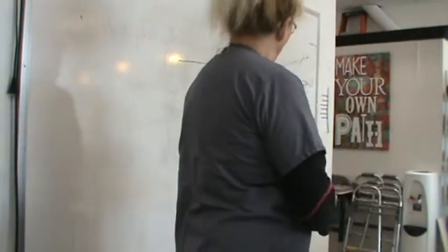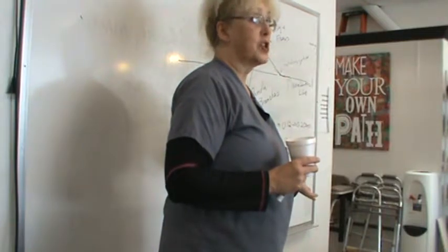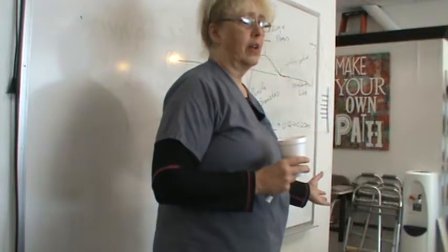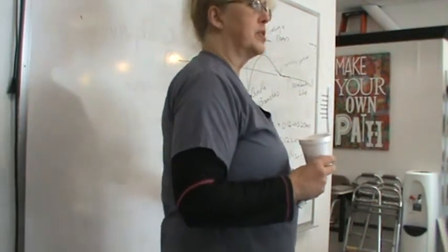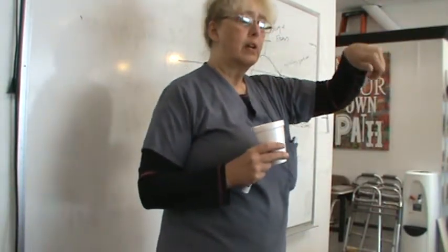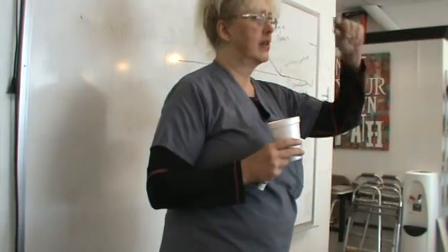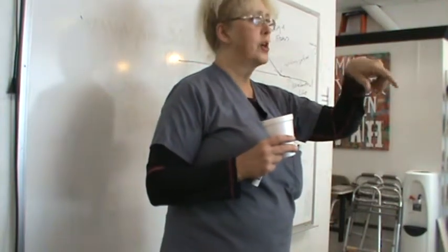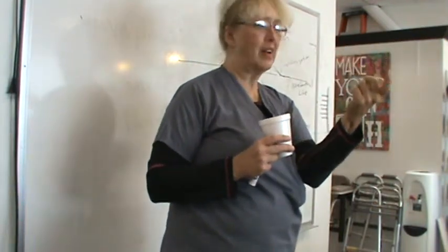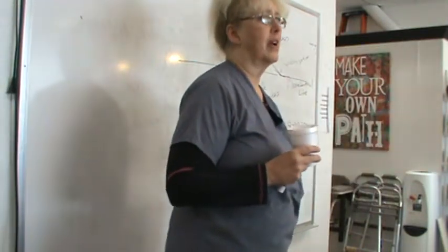And so I'm going to show you how to measure these. If you like this stuff, you might want to get yourself some calipers. Calipers are cool. Remember when you guys were small and you took geometry? Remember the compass, right? Or protractor. I think it was a protractor, wasn't it? Yeah, the protractor. How you could measure things. It had those two sharp little things, and you put a pencil in it. That's what calipers look like. They look like the same thing.